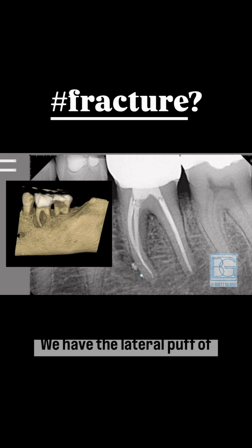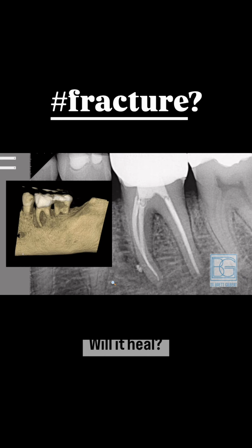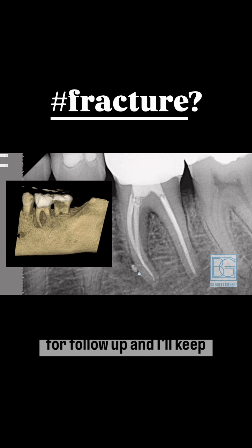We had the lateral puff of bioceramic sealer indicating, as a storyteller, the anatomy, and recognizing that at that location over time, you could see this massive amount of bone loss. So is it fractured? It's possible. Will it heal? We won't know. We'll see the patient back for follow-up, and I'll keep you posted.